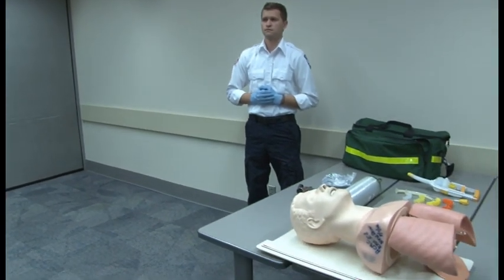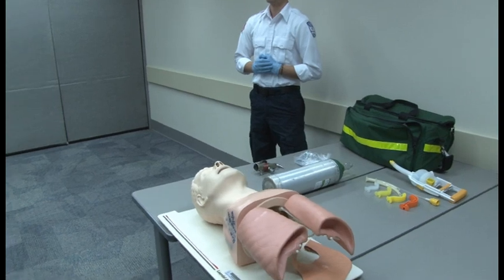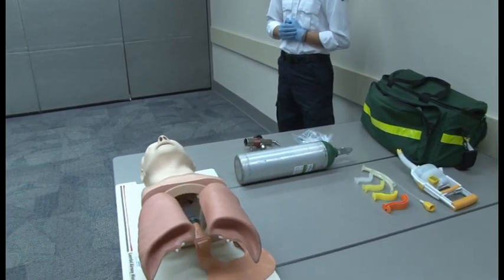Good morning. This skill is designed to evaluate your ability to provide supplemental oxygen administration by non-rebreather mask to an adult patient. The patient has no other associated injuries, this is a non-trauma situation, and cervical precautions are not necessary. You will be required to assemble an oxygen tank and a regulator, then administer oxygen to an adult patient using a non-rebreather mask.